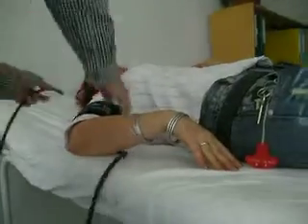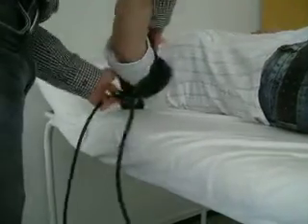Now on to the evaluation. First of all, I will detach the cuff from the patient. That's it. So these are excellent results with excellent waveforms. So we usually prefer the waveforms to have two clearly distinguishable peaks, first and the second peak.